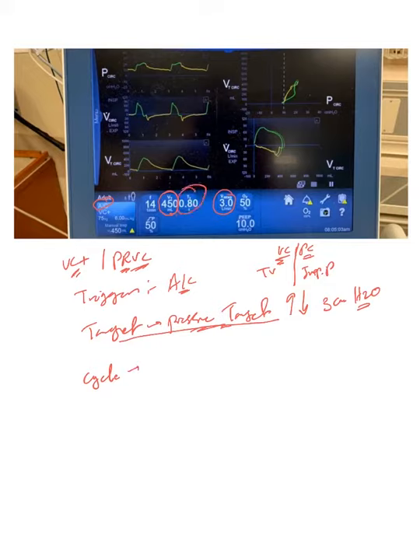So you have to provide tidal volume and then provide inspiratory time directly, like pressure control, or by adjusting the IE ratio. That means you indirectly set the inspiratory time and the cycle. And this belongs to pressure control. So the cycle and the target are similar to pressure control, except the initial test breath where it uses a volume control breath, and it took the fixed tidal volume from the volume control.